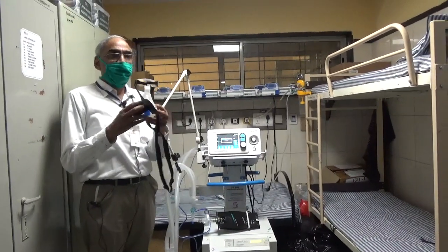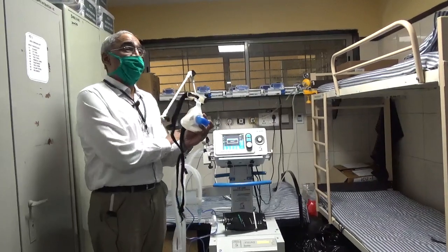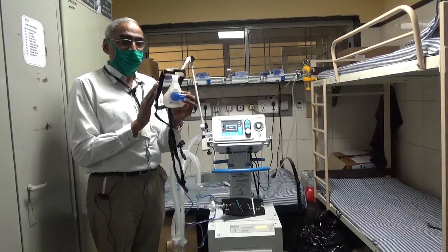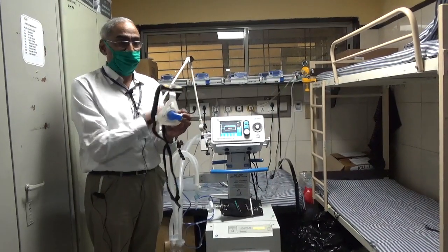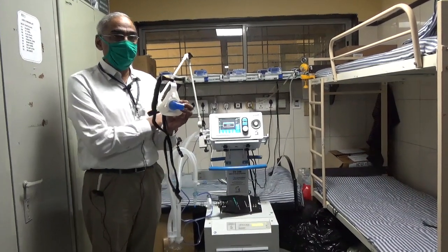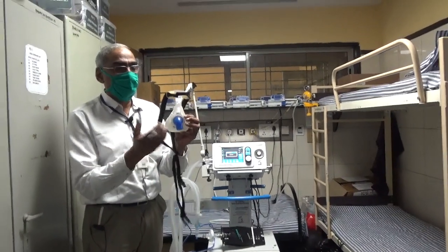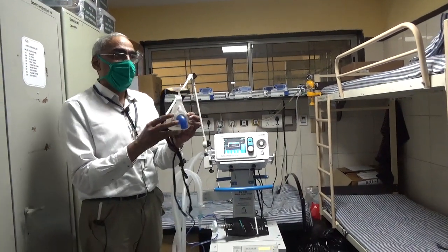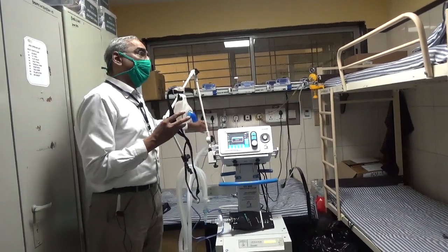This is a face mask of medium size, which is to be used along with the invasive ventilator. Remember, these masks come in two types. One type of mask is to be used with a single limb circuit on the ventilator. This is used for the dedicated non-invasive ventilators, which are called BiPAPs. For the invasive ventilator, there should be a mask which does not have a valve anywhere. Please remember, the air that goes in to the patient also comes out from this mask, and it goes through the expiratory limb of the circuit to the filter and then out.